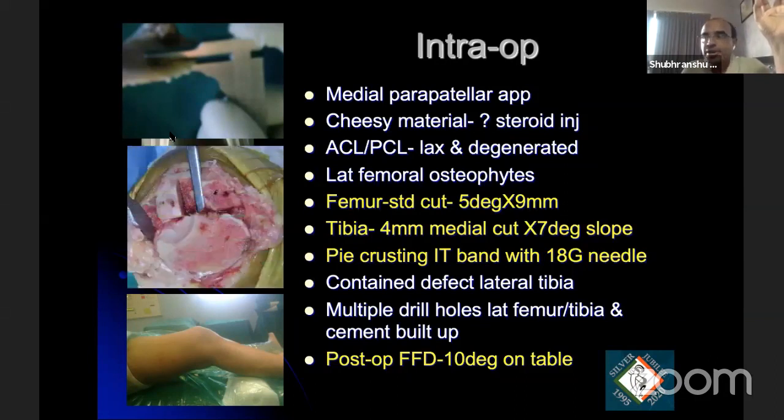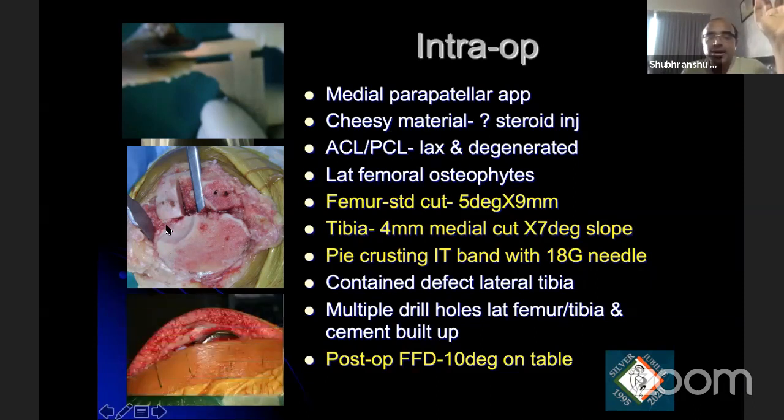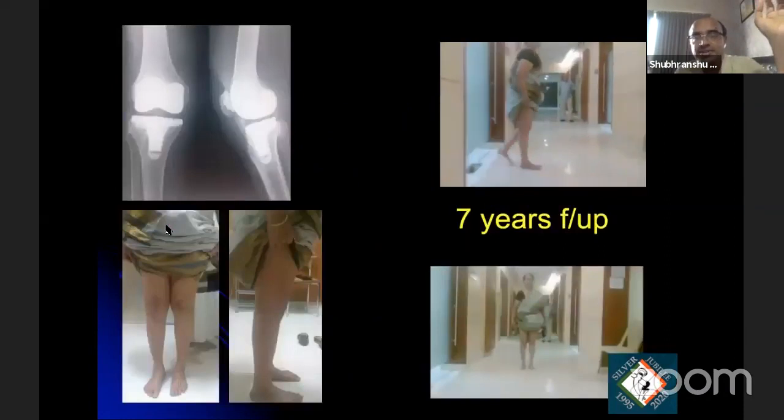There was a contained defect in the posterolateral corner of the tibia, and on the femur there was hard bone where we hardly took any cut, so we had to make multiple drill holes and fill them up with cement. Post-operatively, we left the knee with about 10 degrees of fixed flexion deformity, which eventually stretches out. So in lax knees, please do not achieve a complete correction. You have to leave a little bit of flexion deformity, which eventually corrects out.